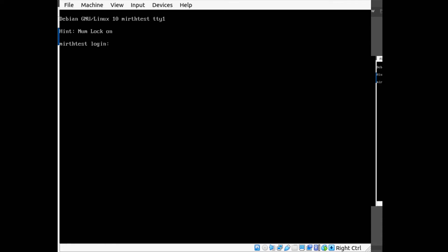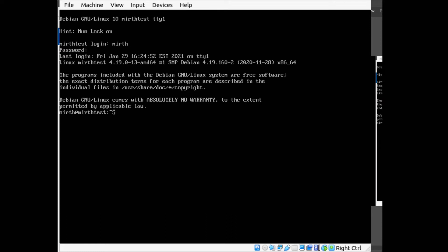The way we do that is through something called systemd, and this is getting into the Linux administration side of things. So I'll try and keep it simple. What you want to do is log in as the MIRTH user with the password there.